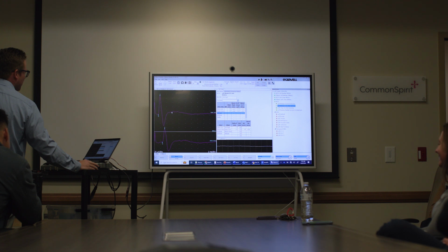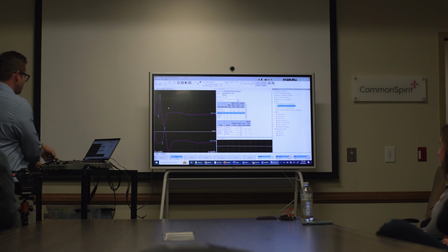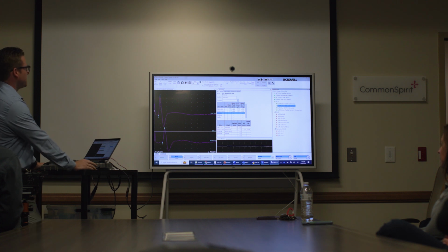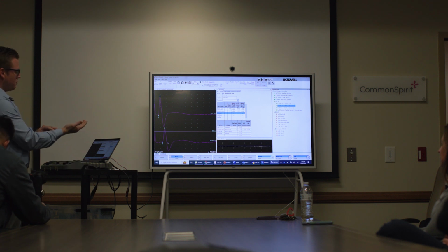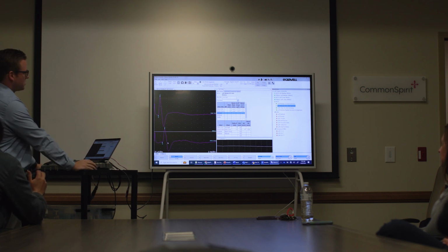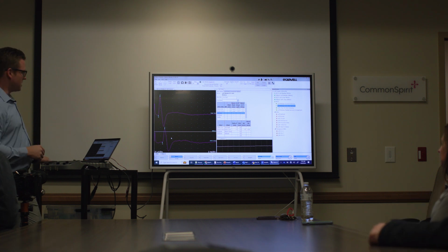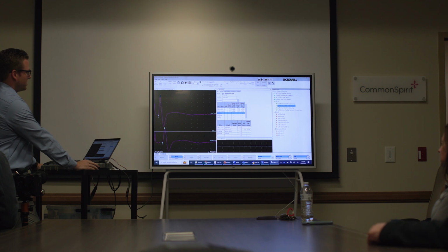Best compliment today. So here, this one is, like I said, very normal. If they had some slowing across the carpal tunnel, for example, this response here is the stimulation in the palm, and then this one down here is down proximal to the wrist. So if there was slowing across the carpal tunnel, we would see this response come in further to the right. If there was demyelination and that nerve was slower getting across that demyelinated segment, we would see that reflected in some of these numbers.